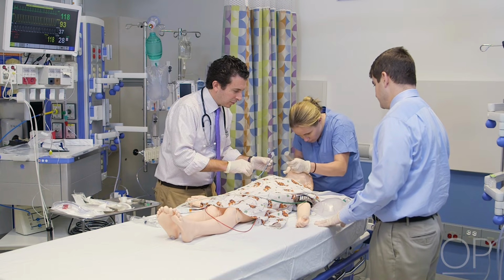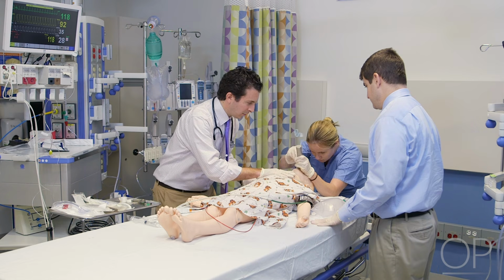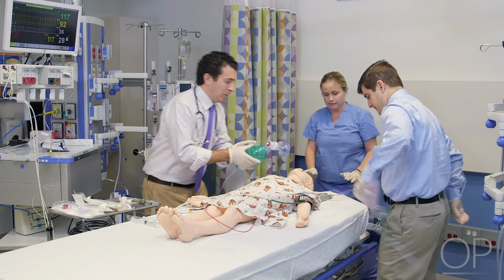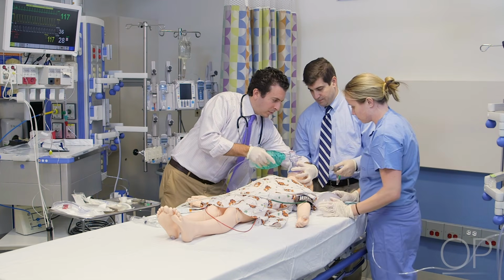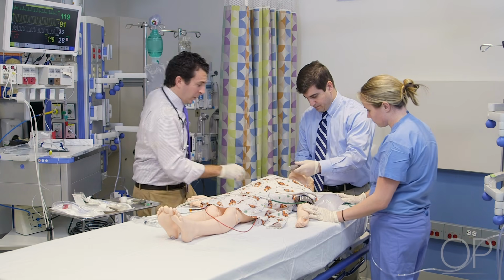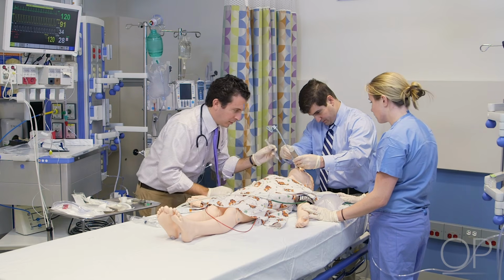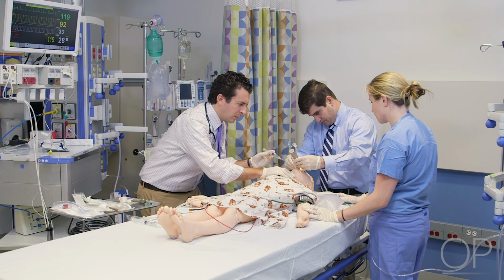Multiple attempts. Physiological and pharmacological optimization, as well as appropriate positioning prior to the procedure, can help minimize repeated attempts. In addition, the intubation skill level should be matched to the anticipated level of difficulty of the procedure. Multiple attempts by a single provider should be avoided. More experienced providers should make subsequent attempts. Calling for help early may be needed to bring appropriate personnel resources.